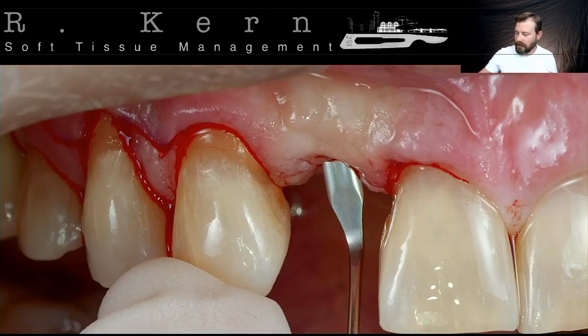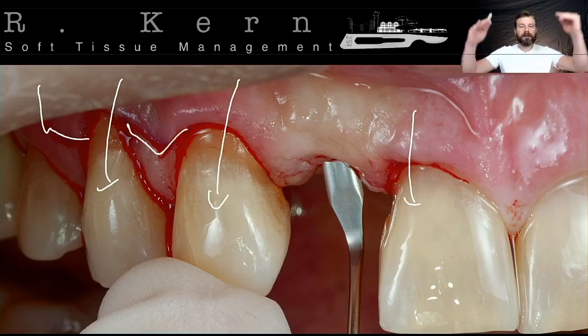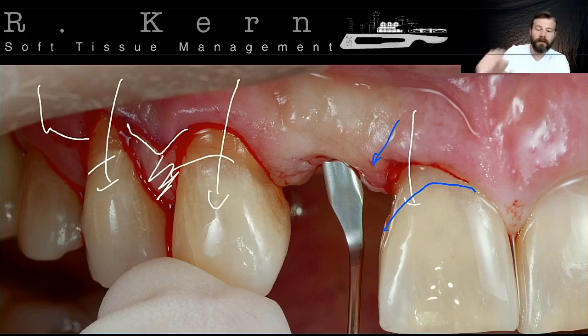We're going to advance coronally the flap here, and of course here. So on this area, on the premolar, we have a release incision like a trapezium, and on the middle we have like a triangular shape to advance this flap over this recipient area and to cover this recession here. No release is needed, of course, on the central incisor, because when I advance the flap here, this contour is going to solve the defect and rearrange the soft tissue contour perfectly on the distal margin of these central incisors, right?